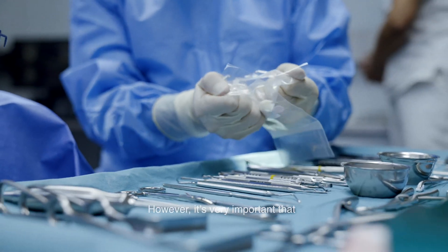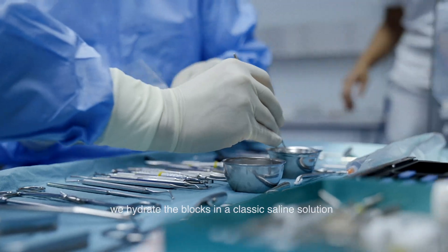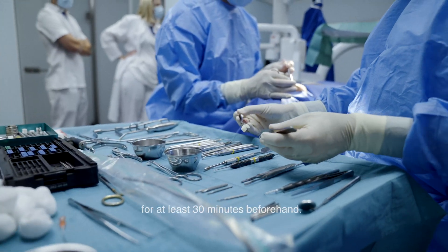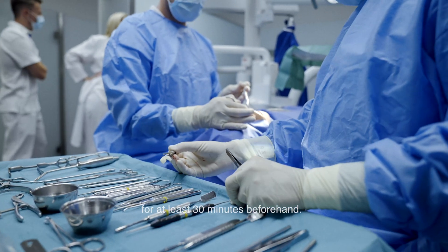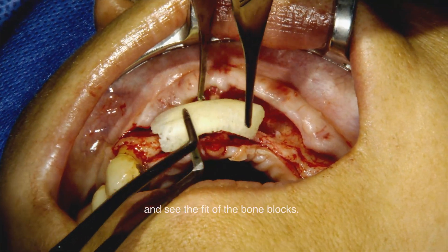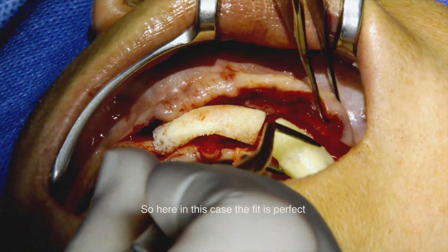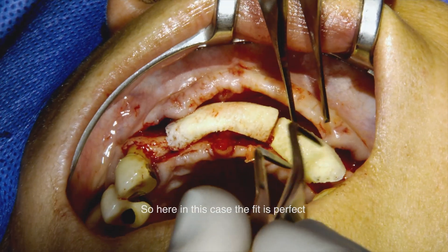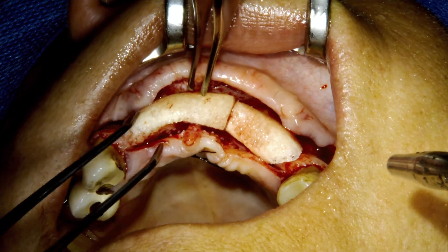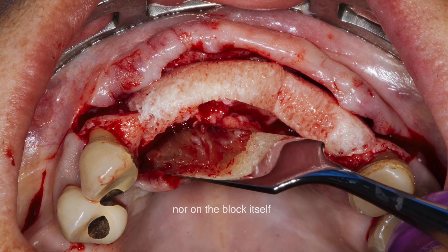It is very important to hydrate the blocks in classic NaCl solution for at least 30 minutes. We then adapt the bone blocks and assess the fit. In this case the fit is perfect — no further adjustments are needed, neither on the bone blocks nor on the defect itself.